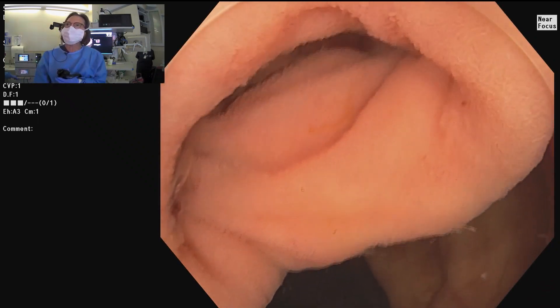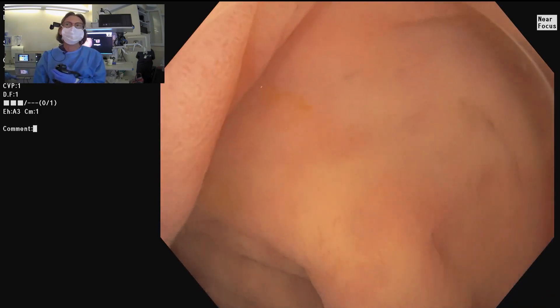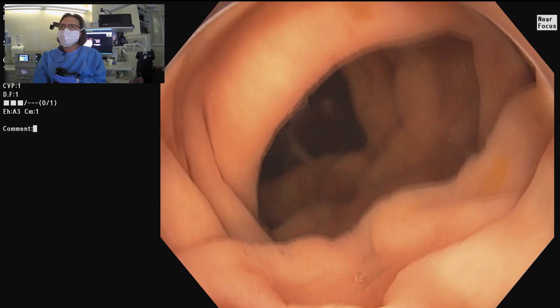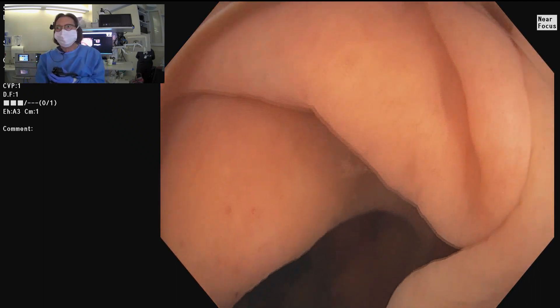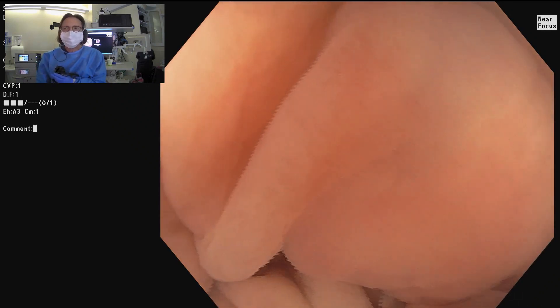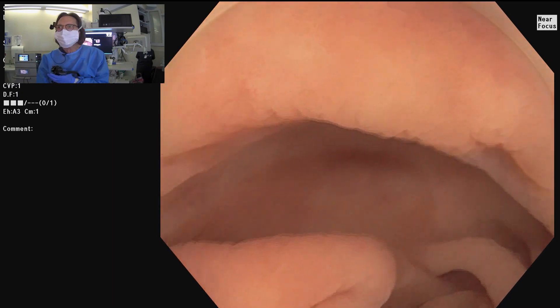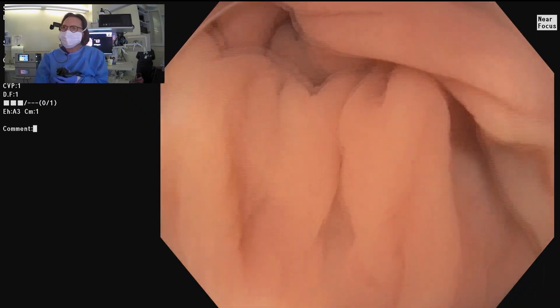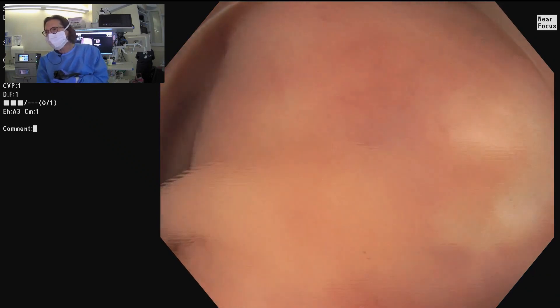As I come out, look at how beautifully we see the IC valve opening — it's just gaping in front of you. That's the reason I've been able to resect these IC valve lesions very efficiently using the underwater technique. I use a global water exchange technique; the gas is turned off the whole time, although I do selectively use gas when I make my diathermic markings around a lesion. I'm basically going around 360 degrees in a helical fashion, using the water jet to interrogate the lumen.